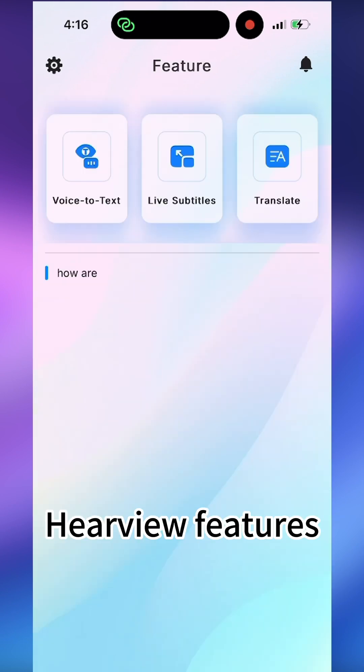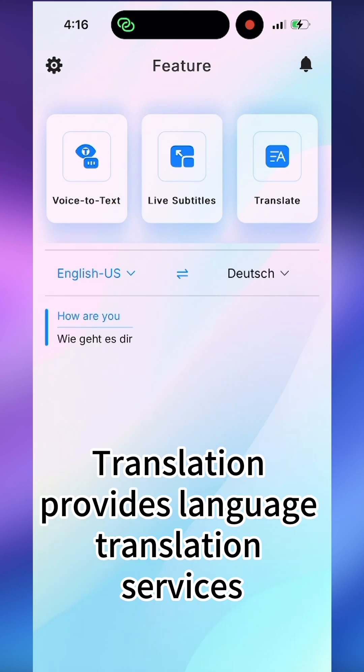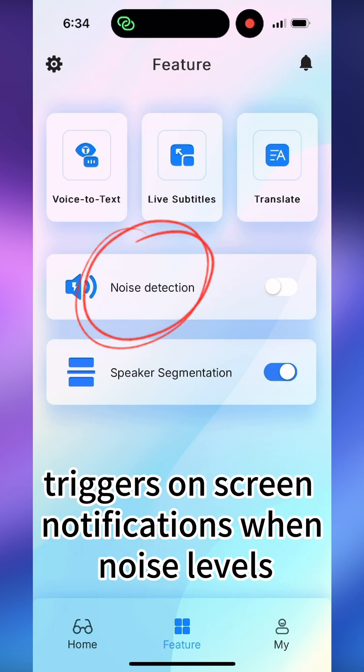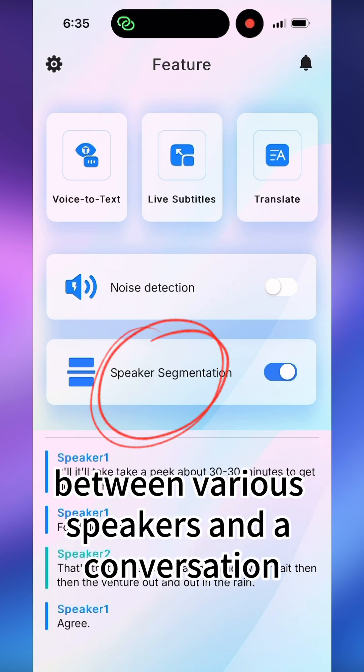HearView features: Voice to text converts speech to text during in-person conversations. Live subtitles displays real-time captions for phone and video content. Translation provides language translation services. Noise detection triggers on-screen notifications when noise levels exceed 80 decibels. Speaker segmentation differentiates between various speakers in a conversation.